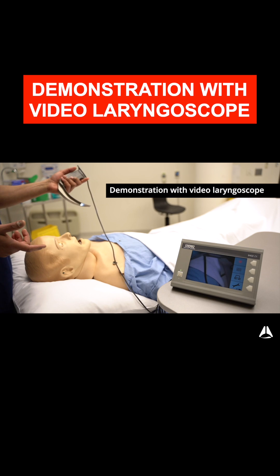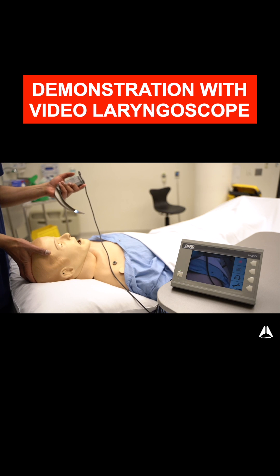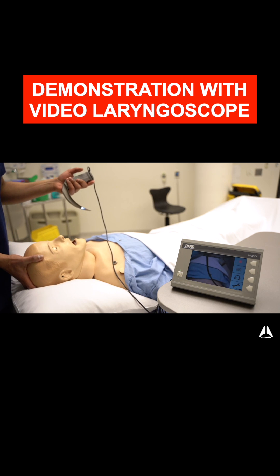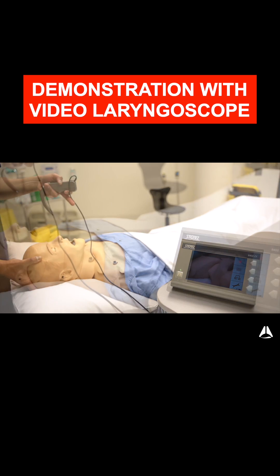So just to demonstrate with a video laryngoscope. Now these first few steps — I need to get my right hand on the head, and that allows me to angle the neck back, angle the head back, and this opens up the mouth, giving me a much better trajectory to the trachea.